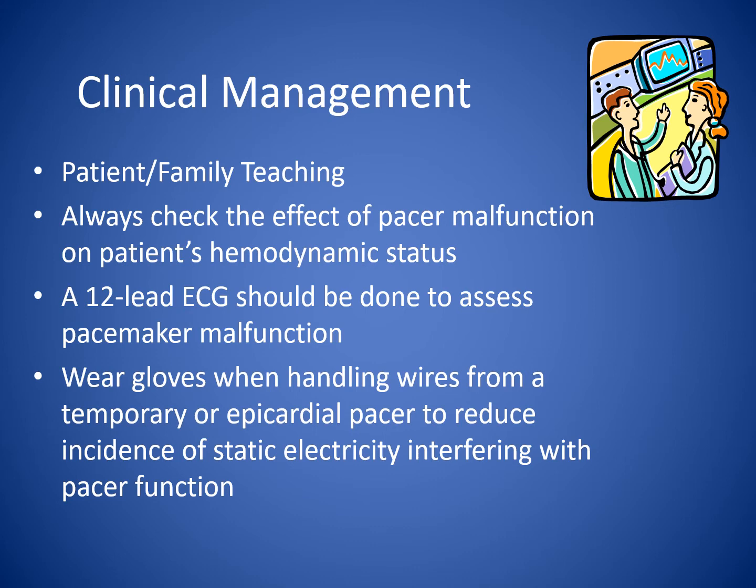So with clinical management, there's a couple things you should be aware of. It is very important to make sure you have patient and family teaching. Let them be aware of how to take care of themselves, things to avoid. Always check the effect of pacer malfunction on the patient's hemodynamic status. A 12-lead EKG should be done to assess the pacemaker malfunction. And be aware that you should wear gloves when handling wires from a temporary or epicardial pacer to reduce incidence of static electricity interfering with pacer function.